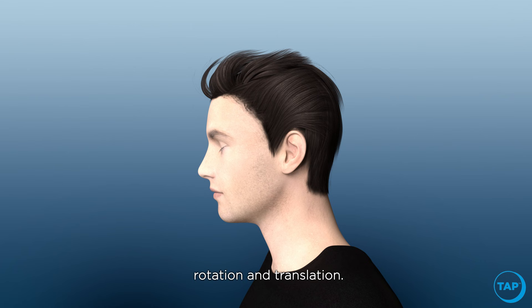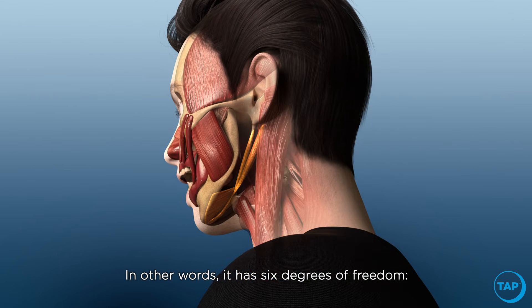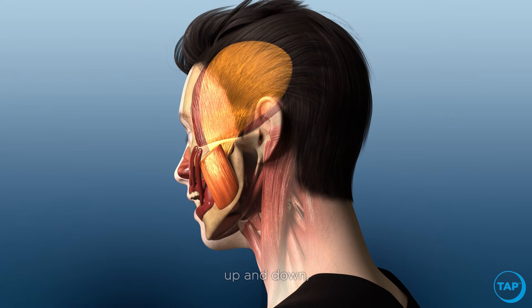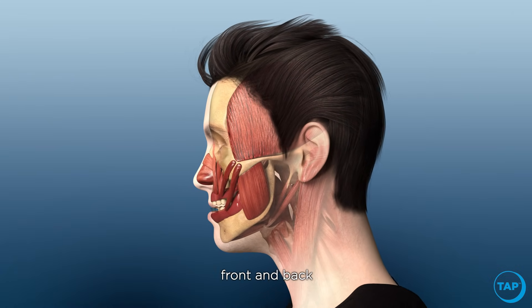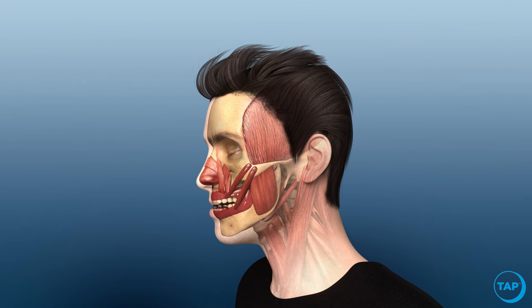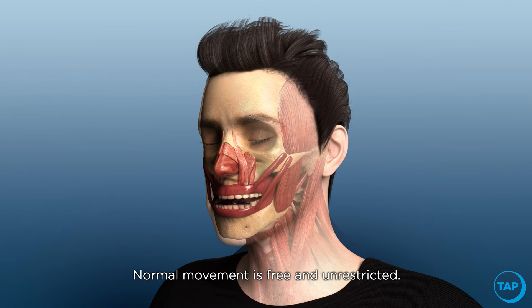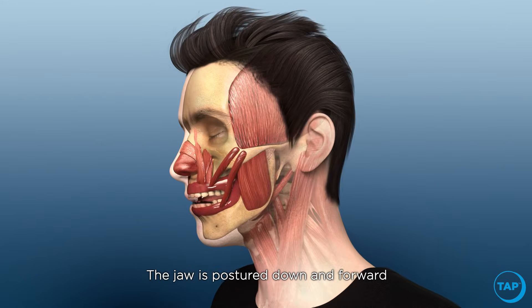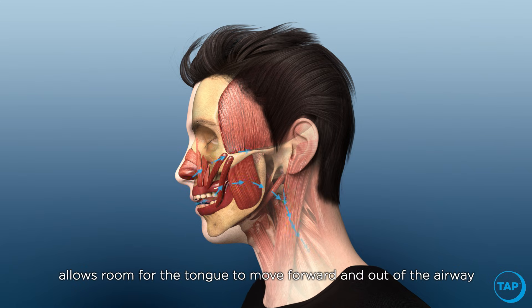Jaw joints have two independent movements: rotation and translation. In other words, it has six degrees of freedom — up and down, front and back, and right to left. Normal movement is free and unrestricted. The jaw is postured down and forward with no rotation during normal breathing. This increased space between the teeth, called freeway space, allows room for the tongue to move forward and out of the airway.